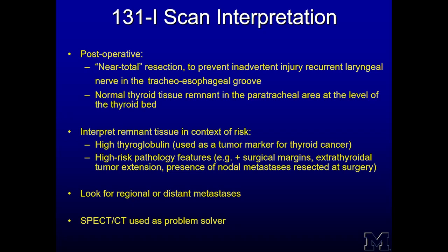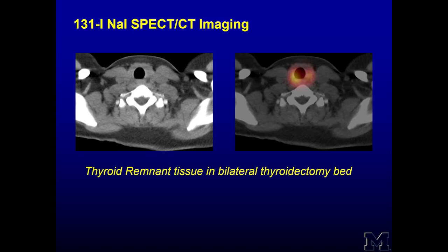We'll look for regional and distant metastases which concentrate iodine, and usually SPECT-CT is used as a problem solver. Here it's actually utilization of SPECT-CT imaging for characterization of the thyroid tissue seen in the central neck.